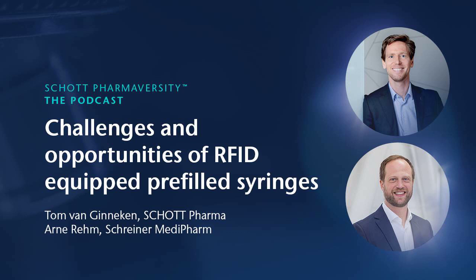So it's much more difficult to steal controlled substances because every syringe movement can be logged by time, place, and also who took it. So also another example is potential drug recalls, which are much easier to handle. Where in the past, every drug storage needed to be screened to look for the affected drug and the batch. Now with the complete transparency that is available, everything can be looked at in one overview.